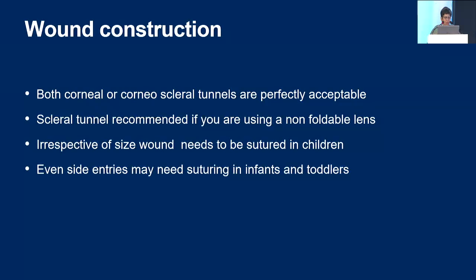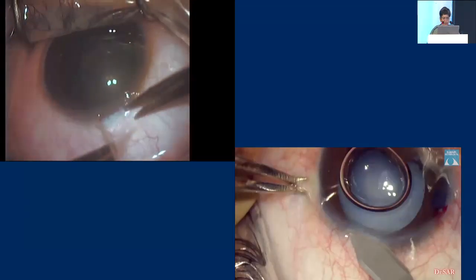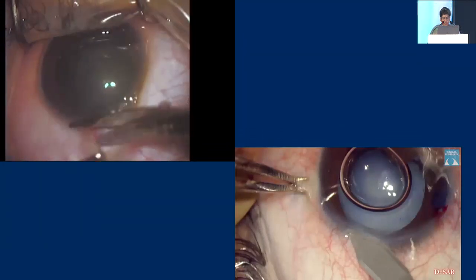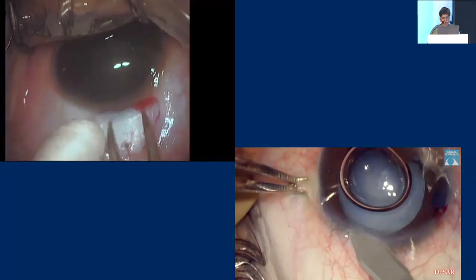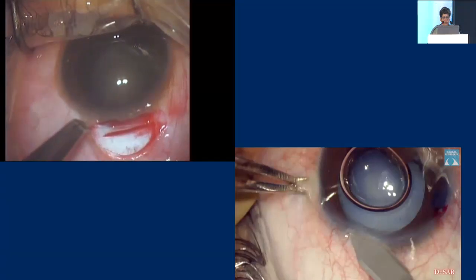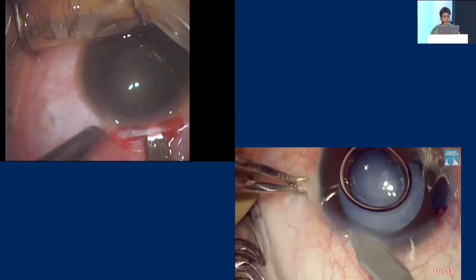Irrespective of the size of the wound — whether it is 2.2, 3.2, or 4.5 — you definitely need to suture in almost all children up to 12 years of age. Even side entries may need suturing in infants and toddlers. This is a corneoscleral wound, as you can see. You are going to make a little conjunctival opening, and that can sometimes be a problem because some of these children may need glaucoma surgeries later on — so the less you touch the conjunctiva, the better.